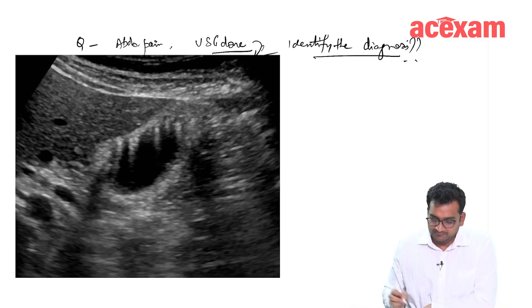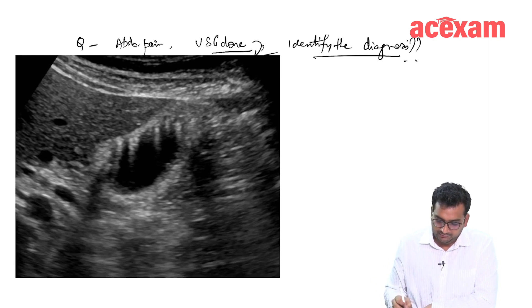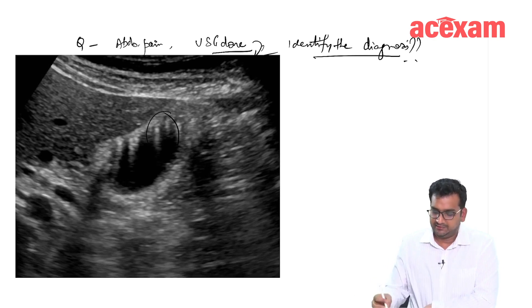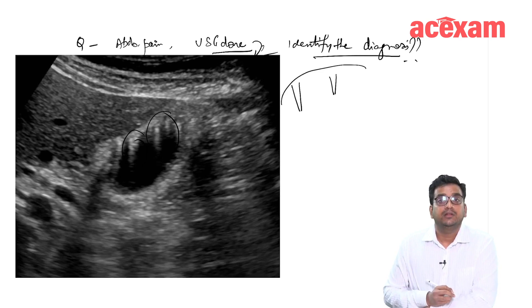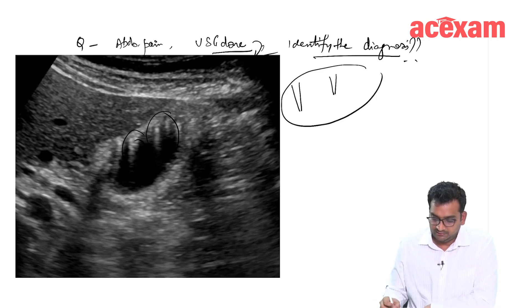What we can see here are these kinds of artifacts. These kinds of artifacts are visible in the gallbladder wall. The diagnosis is adenomyomatosis.